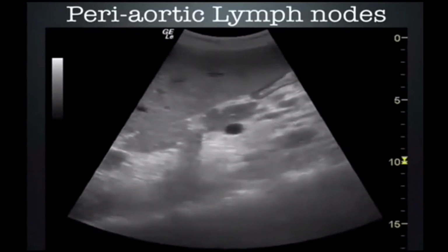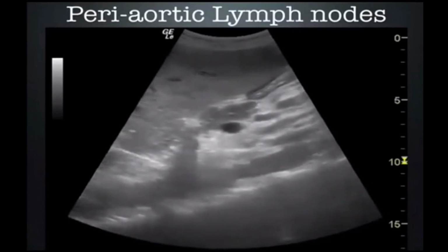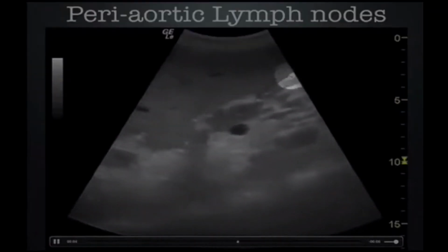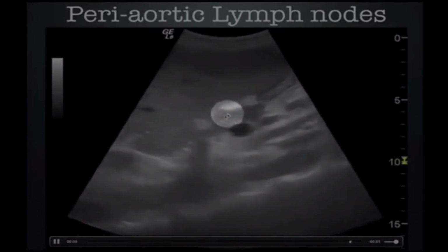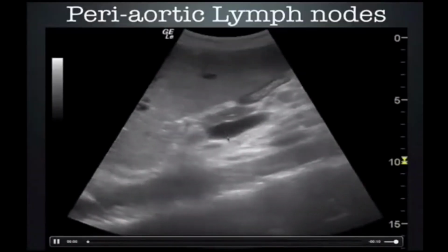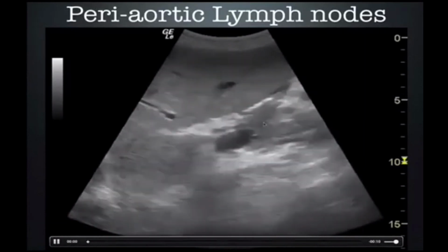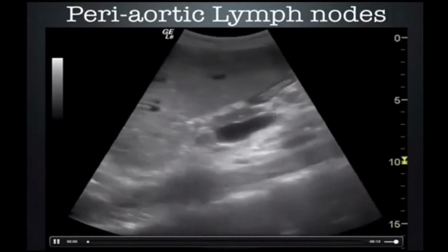This would be a great time to review some of the anatomy that we've already been through, and maybe even add a couple more structures. This is the liver right here. This structure right here that's folded down on itself, this is actually the stomach. The structure here is the pancreas. That is quite visible on this ultrasound image. The structure right here is your portal vein. And as you follow it down, here is the superior mesenteric vein. Portal vein again, coming down to superior mesenteric vein.